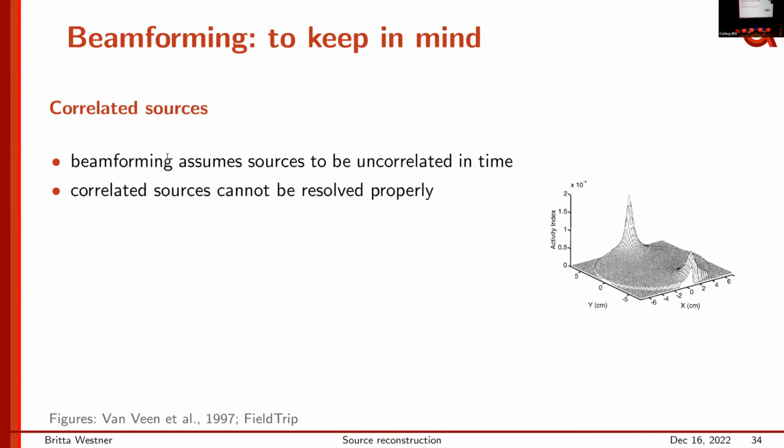Now, if you move to even more advanced models that do not only model the boundaries of your conductors, like boundary element modeling does, but basically all the little compartments inside this conductor, finite element modeling, there I think this becomes more realistic to do.